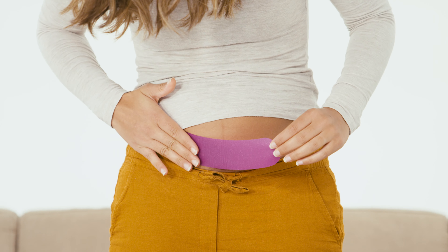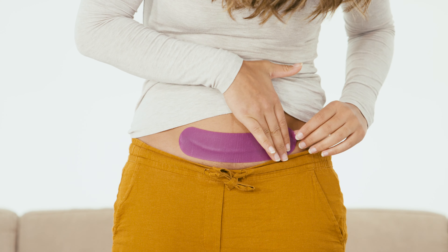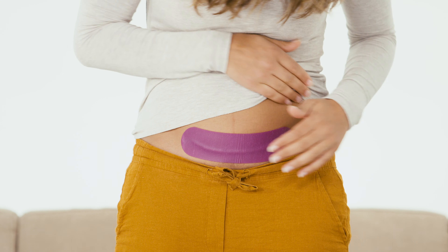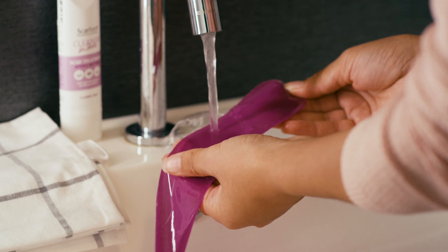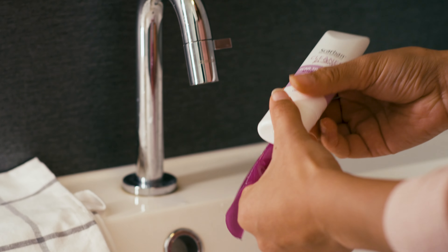If necessary, the sheet can be fixed with an adhesive or stretch dressing. After the silicone sheet is removed, the skin can be treated with a hydrating cream. Scar Band silicone sheets should be cleaned daily in order to maintain their adhesive strength.